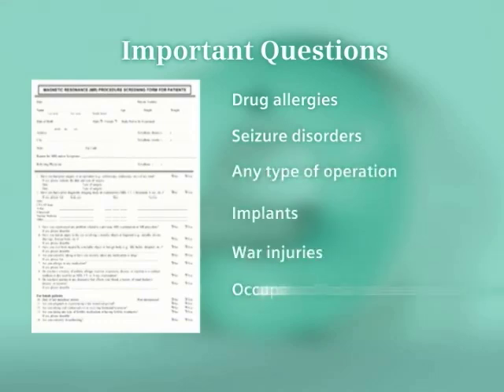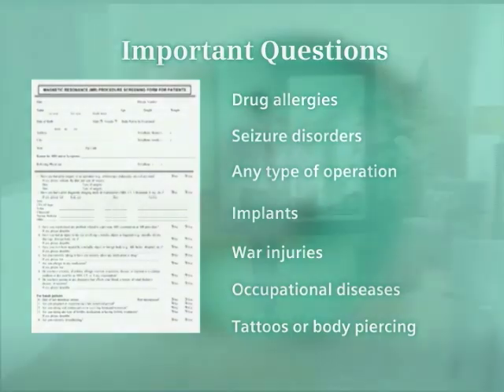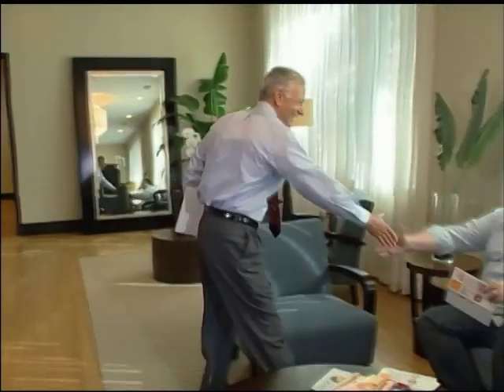All questions in the medical history questionnaire must be clearly answered. It must be signed by the patient, as well as by medical personnel directing the patient care. If the patient is not able to answer the questions accurately, a family member should be consulted and must also sign, or the patient's legal guardian. These questionnaires are to be added to the medical record.